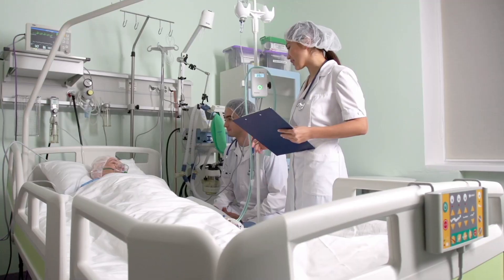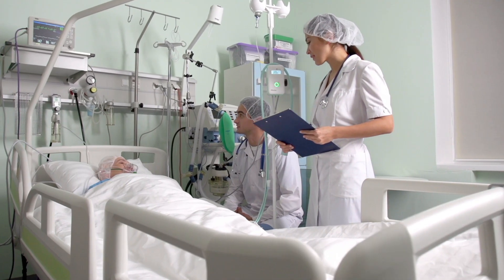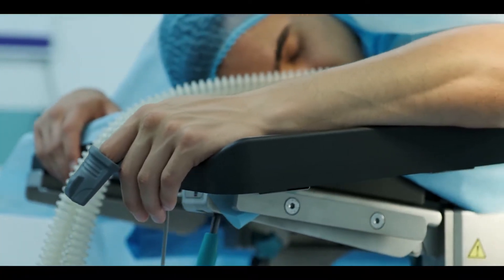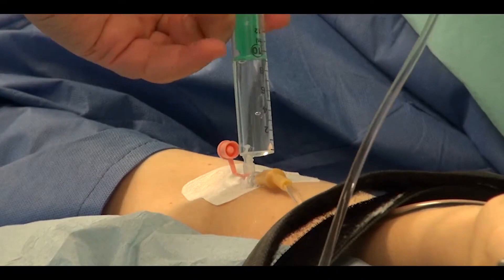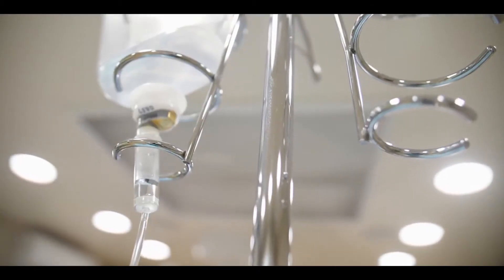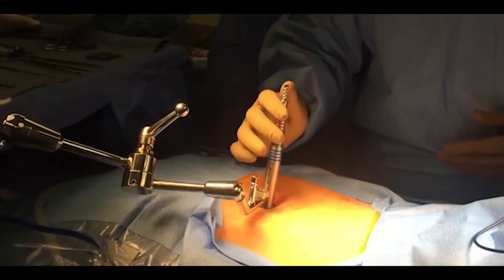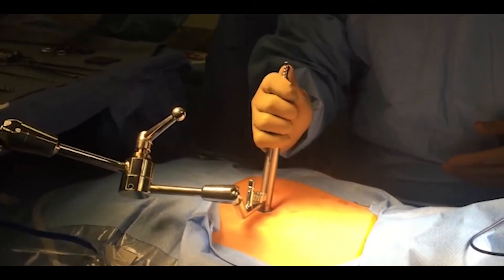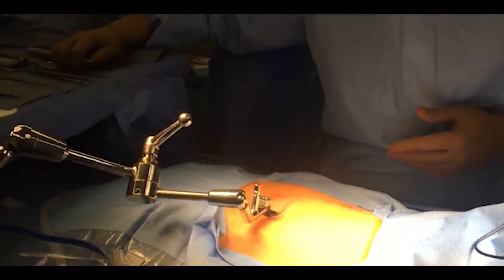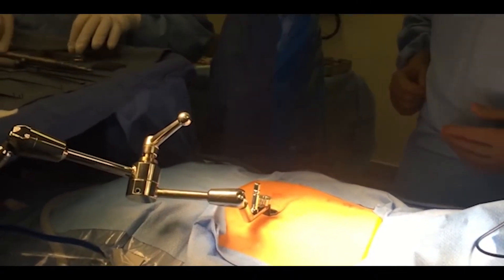How is microdisectomy performed? A step-by-step procedure is as follows. A patient is laid down on their stomach, fully anesthetized, breathed through a breathing tube, and gets nutrients intravenously. The surgeon makes a small incision in the skin and uses special retractors to reach the herniated disc area without damaging the nearby tissues and muscles.